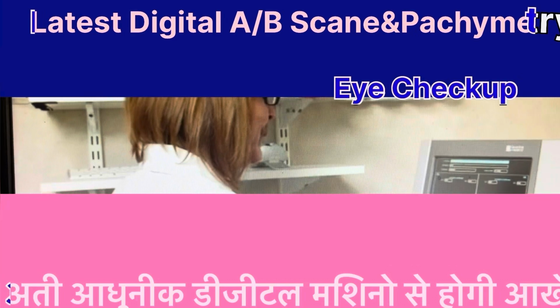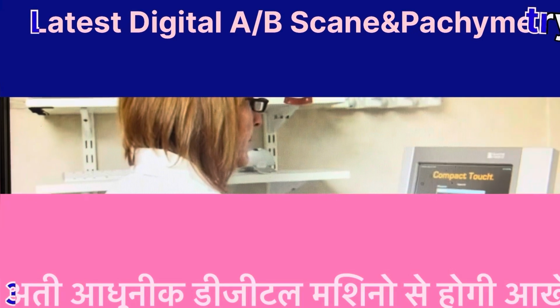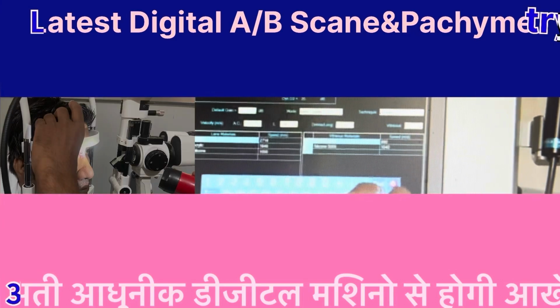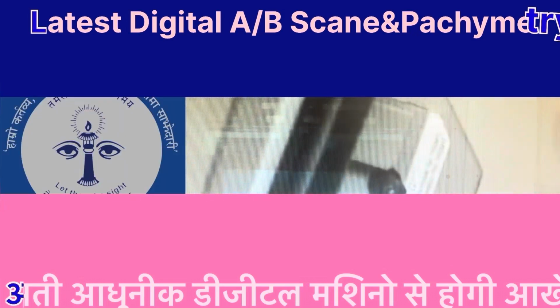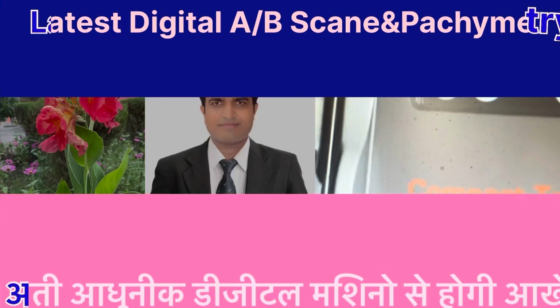Compact Touch, the 3-in-1 ultrasound system from Quantel Medical, is designed to combine cutting-edge imaging technology with a convenient small size. This video will demonstrate how to set up and operate the device, highlighting its main functions and offering some troubleshooting tips. The portable, versatile Compact Touch can be used for A-scan, B-scan, IOL calculation, and corneal pachymetry.